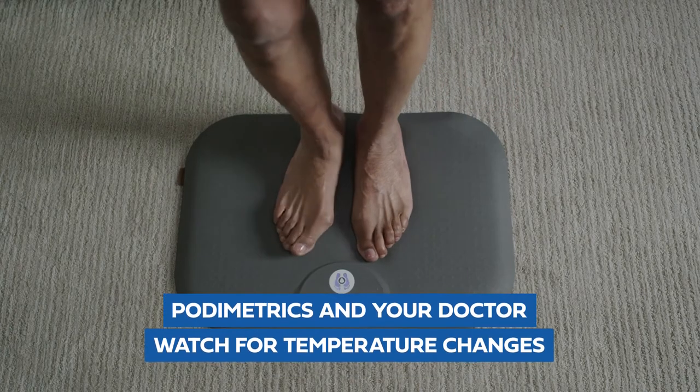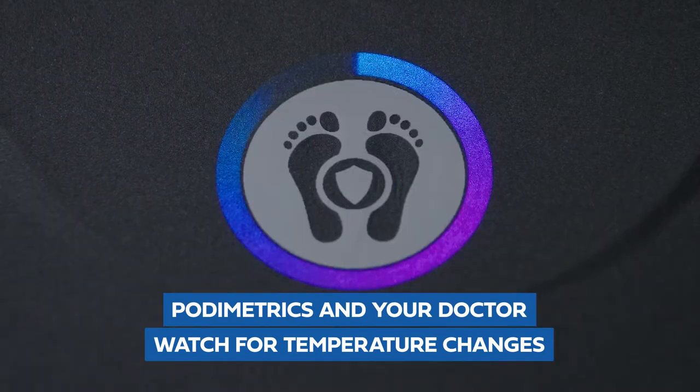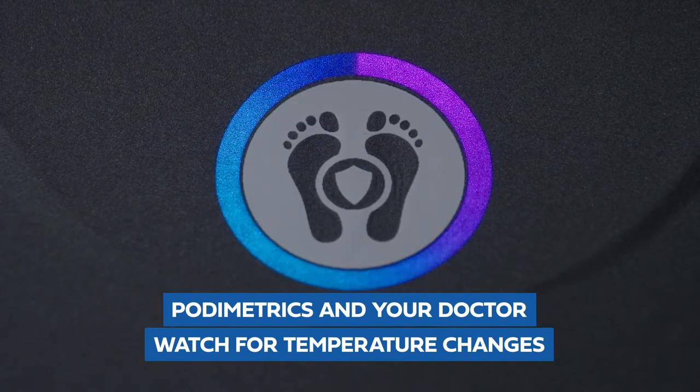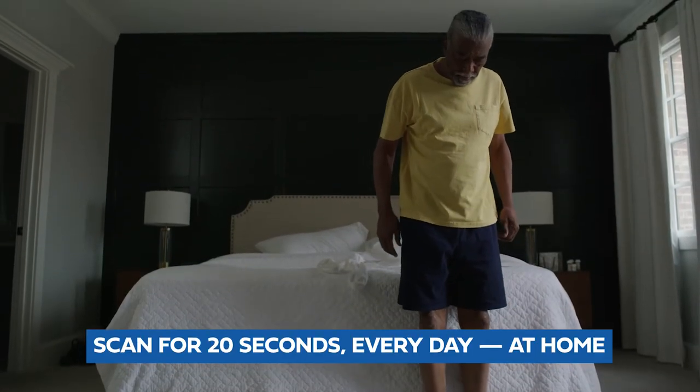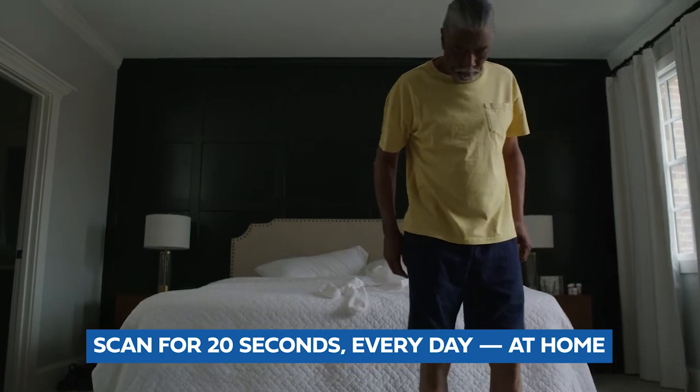When you scan your feet, Podometrics and your doctor can watch for concerning temperature changes, which could mean you are at risk for a foot wound. All you have to do is step on the Smart Mat for 20 seconds every day, right in the comfort of your own home.